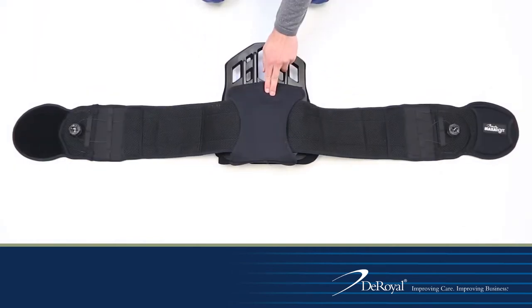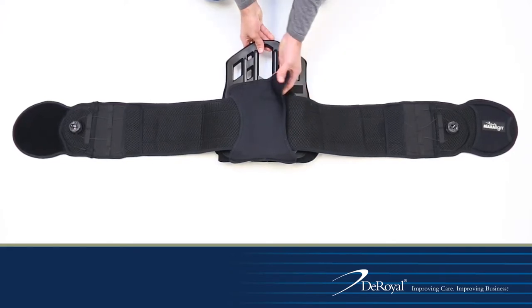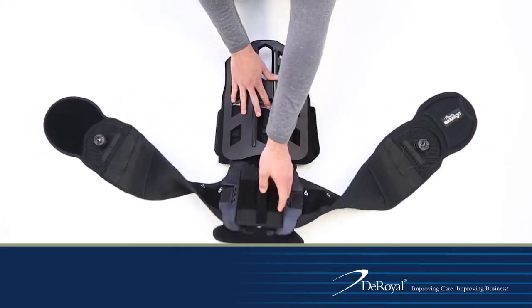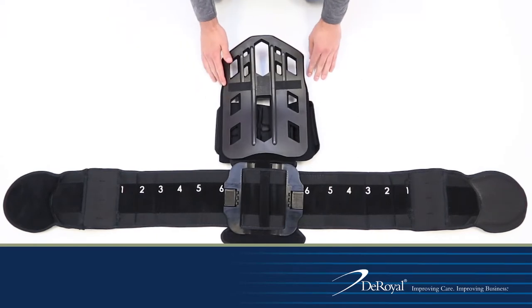Place the brace face down with the Deroyle embossed privacy panel facing up. Ensure the belt arms are spread out completely and non-impinged. Unfasten the back panel hook closure and flip over the back panel and belt arms to reveal the brace sizing adjustment mechanism.